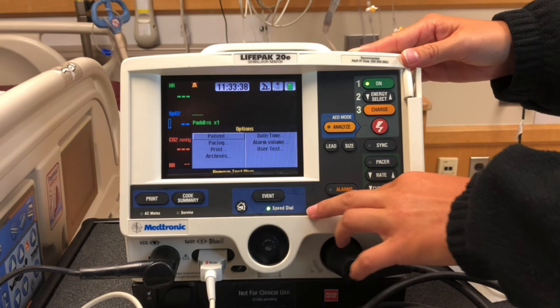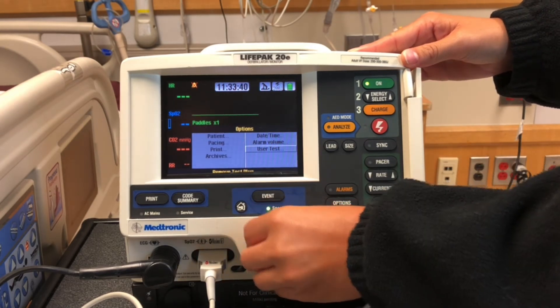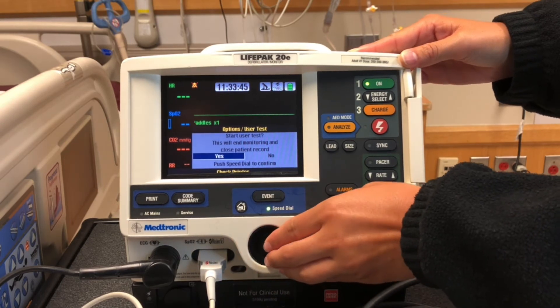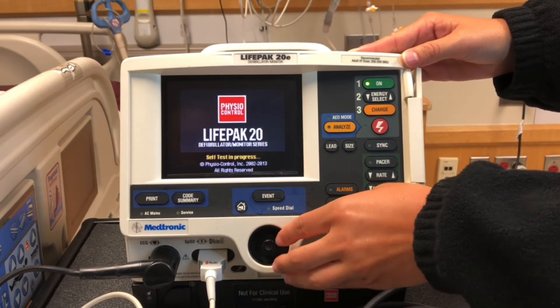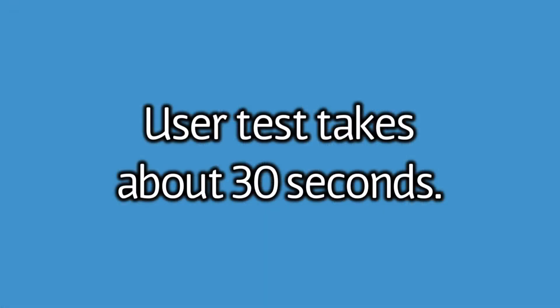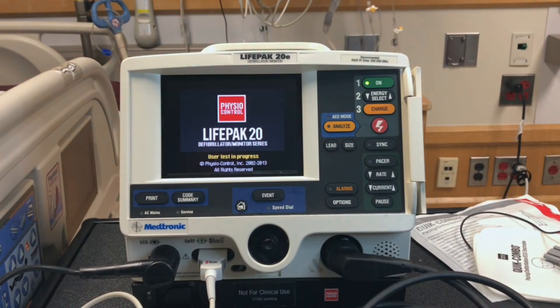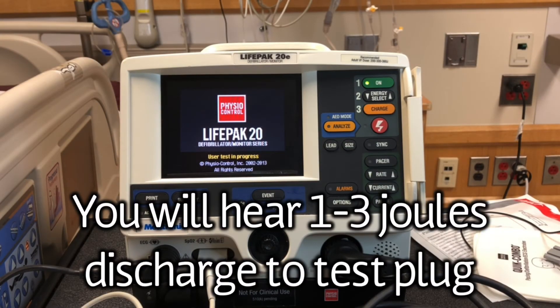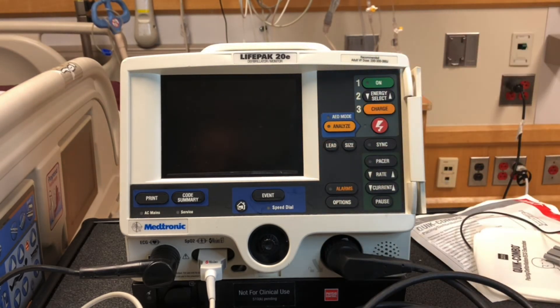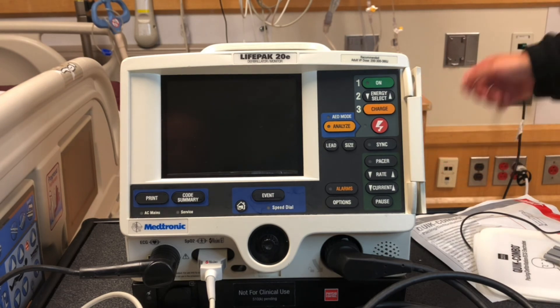Hit options and select user test, then click yes. User test is in progress. Once the test has succeeded as shown on the monitor, it will power down. Make sure you reconnect the power to the LifePak, either from the connection in the back or the wall.